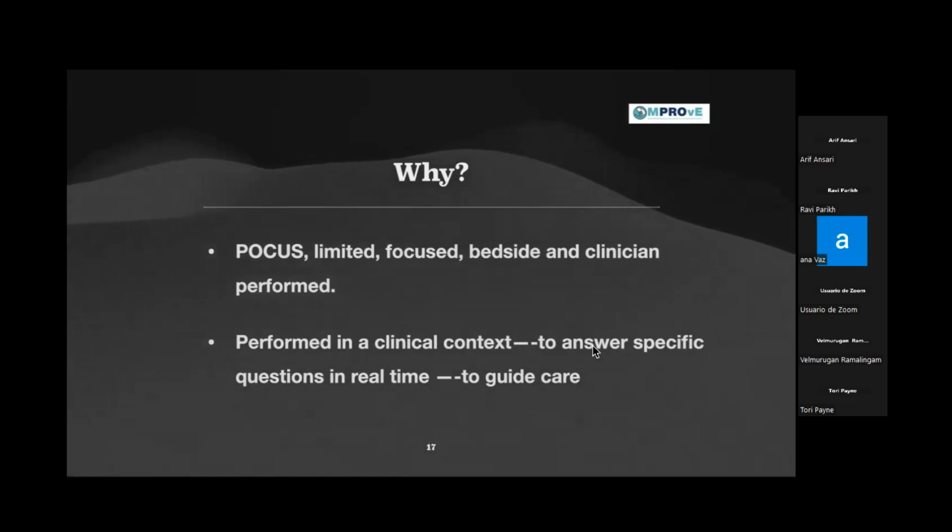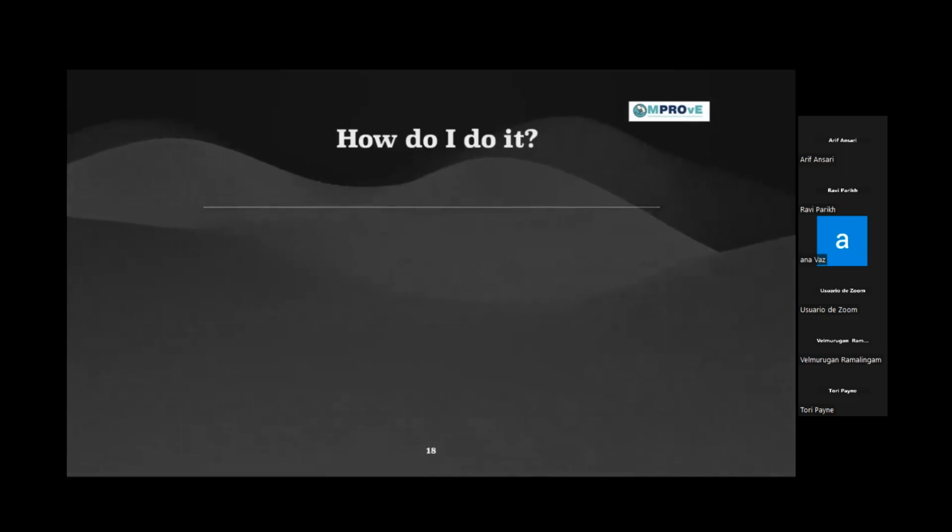Or some people might say, okay, 29.5%, let's consider that as 30% and give some surfactant. Or, after 2 hours, you can see on the CPAP of 8 centimeters the baby is turning the corner, the oxygen requirement is falling down, and you think retrospectively, okay, we were dealing with TTN in this case. But with the lung ultrasound, you'll get the answer then and there by the bedside.